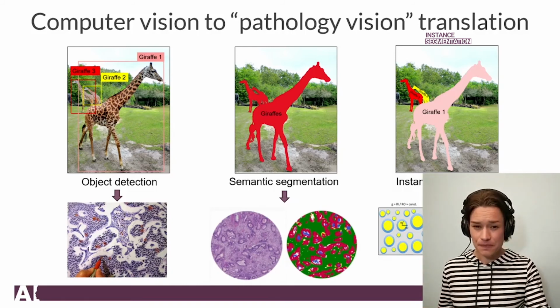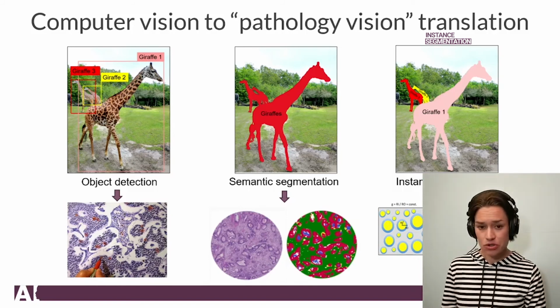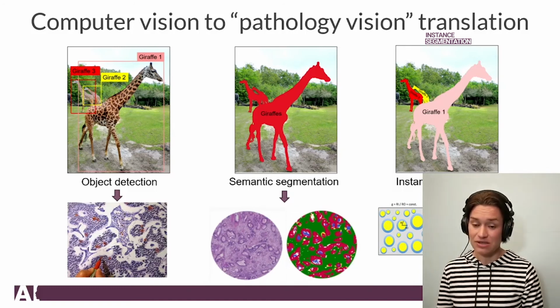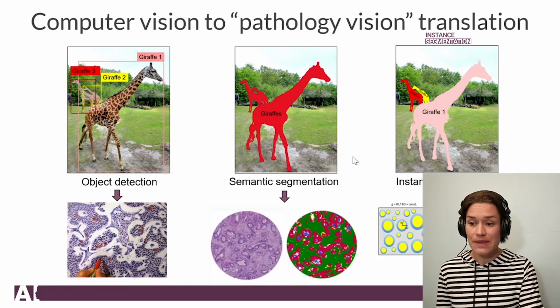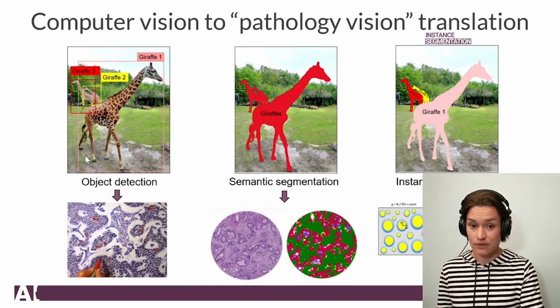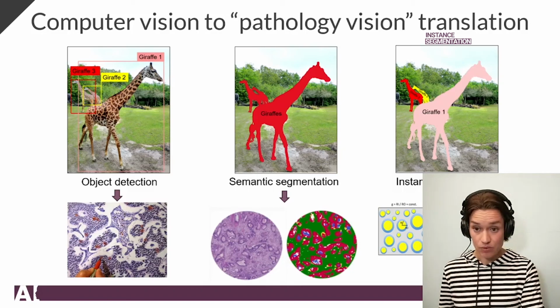You may say, why don't we always do instance segmentation? If it has everything, we should always do it. Well, unlike our brain and eyes, computers are not that efficient. It basically costs a lot more computational power to deliver this kind of data than just those bounding boxes. So if we don't need to use the heavy machinery, why should we have to pay for this? And it's always a cost to benefit ratio.